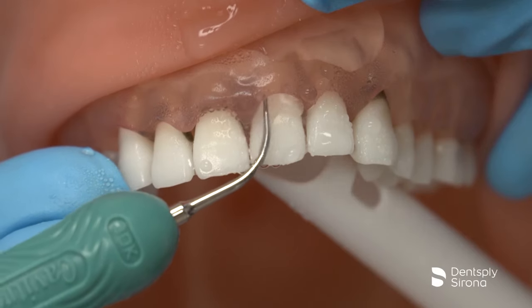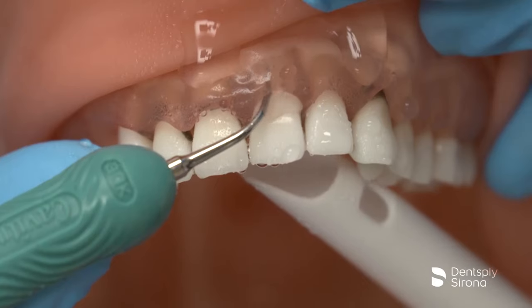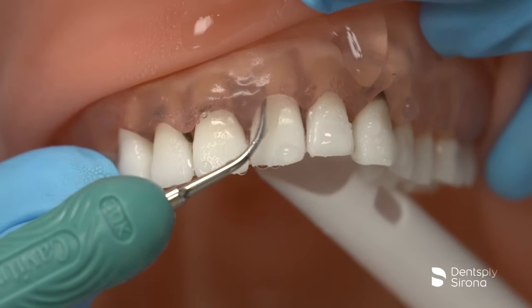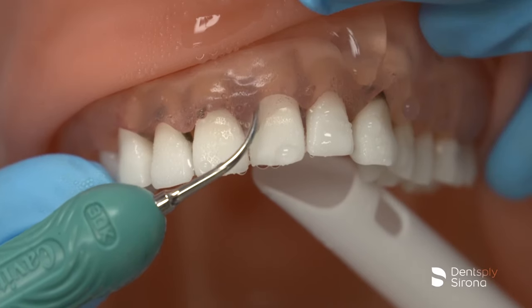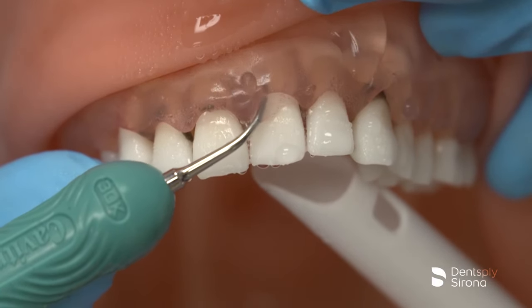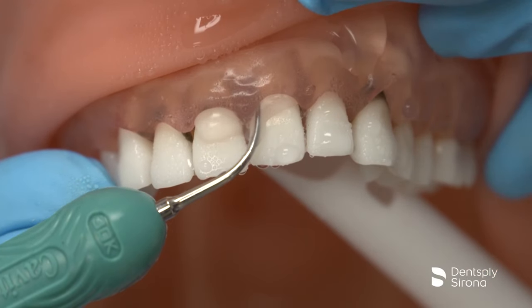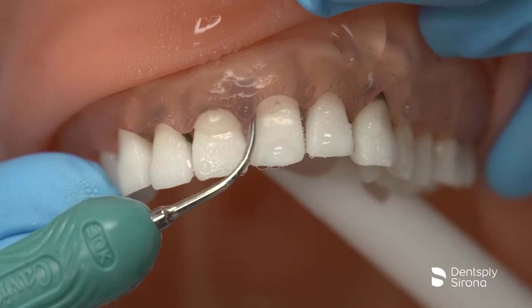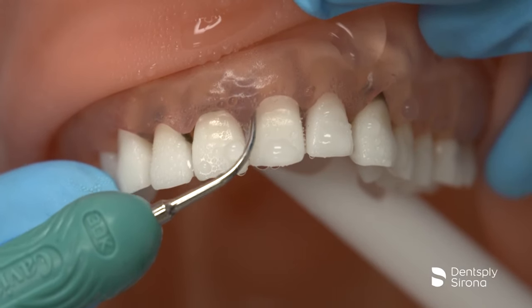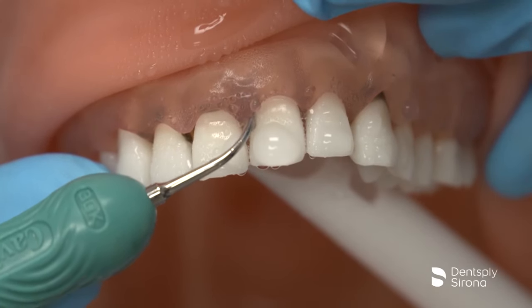As the clinician moves toward the interproximal area, it is important to angulate the insert so that 2-3 mm of the terminal end is always adapted. Following the vertical orientation, the clinician will adapt in a transverse approach under the contact areas for complete debridement. Knowledge of each area of anatomy is essential for successful removal of calculus. A thorough periodontal charting and accompanying radiographs are also essential tools for effective ultrasonic instrumentation.